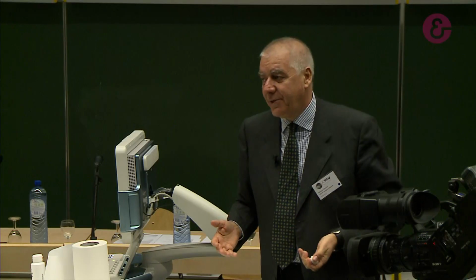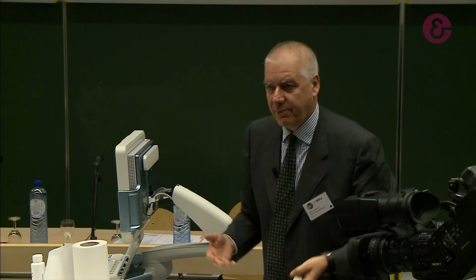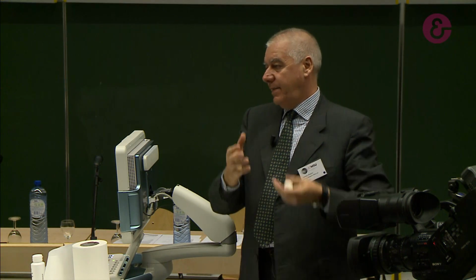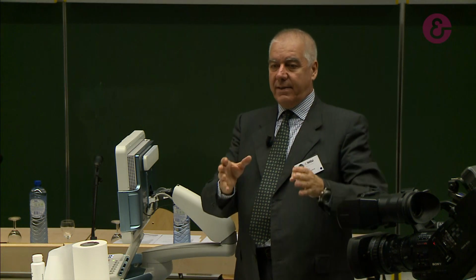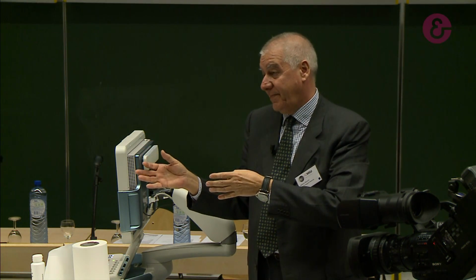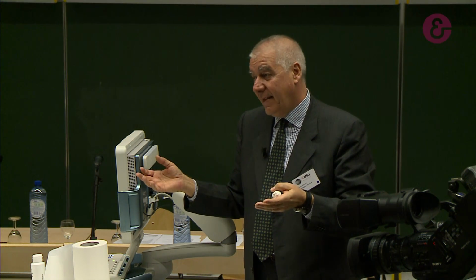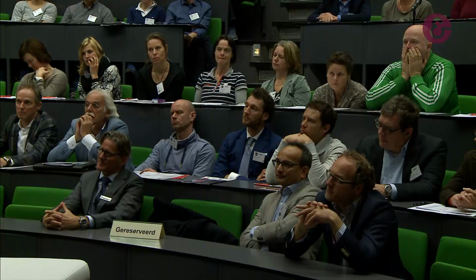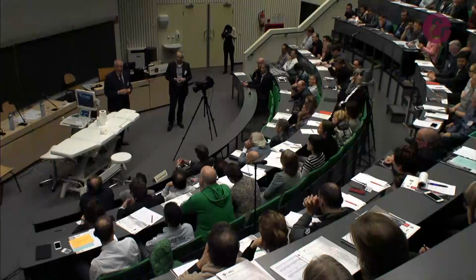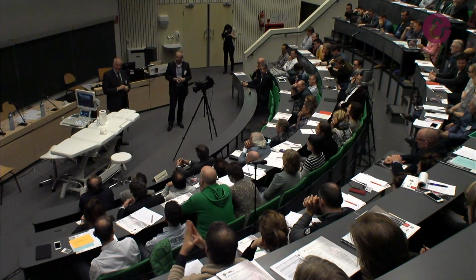When I start the examination, I always start with the same sentence to the patient. You make the EMG, the neurologic studies. This is function. I can tell you morphology. It's not the same thing. So the surgeon must probably have the two. But it's exact. Sometimes it's disappointing.